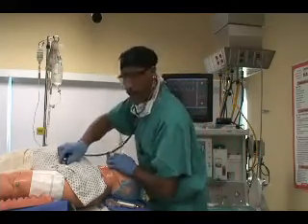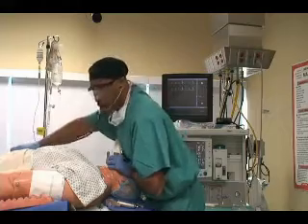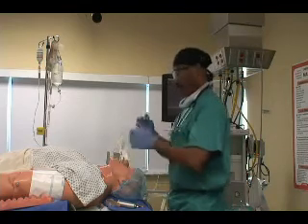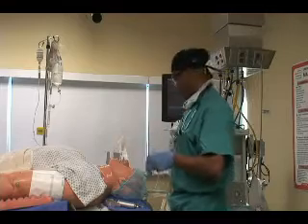Listen to left lung, left, right, and stomach. Once you're sure about placement of your ET tube, grab your tape and tape your tube in place.